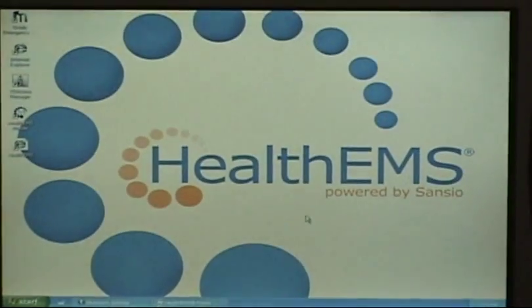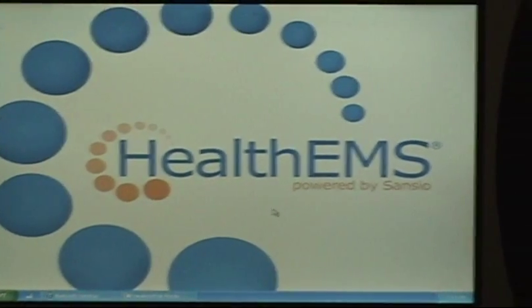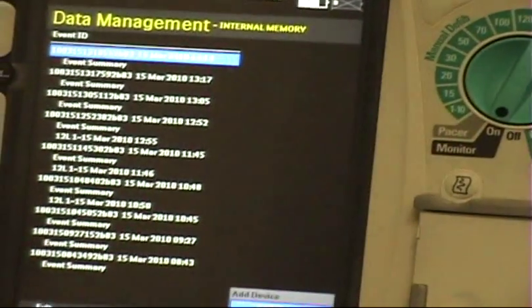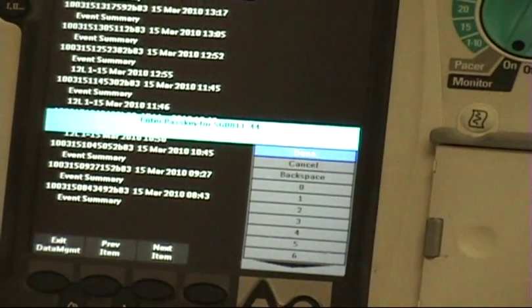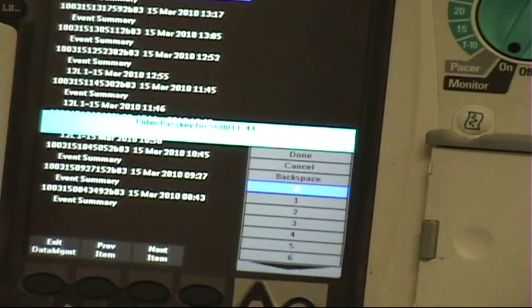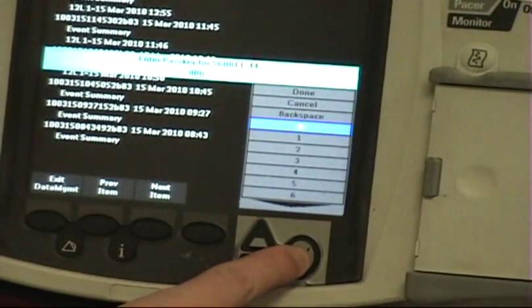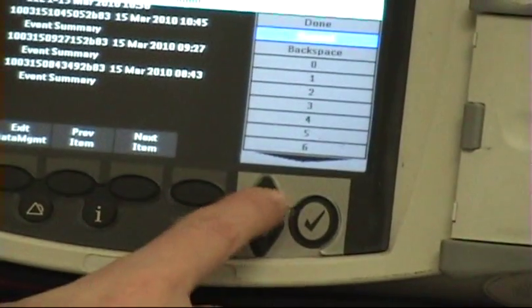There may be other Bluetooth devices in the area, so when it pulls up the device list, make sure you've got your Bluetooth and not your neighbor's. In this instance we've only got one, so we're going to select it — it's number 44. It's going to give you a passcode prompt. When you enter this code, it doesn't matter what it is, you just need to remember it — four digits. For this purpose I'm going to put four zeros. Toggle up and hit done.